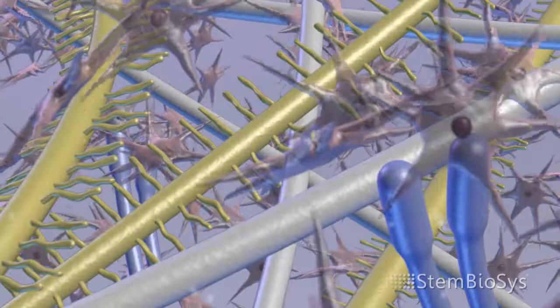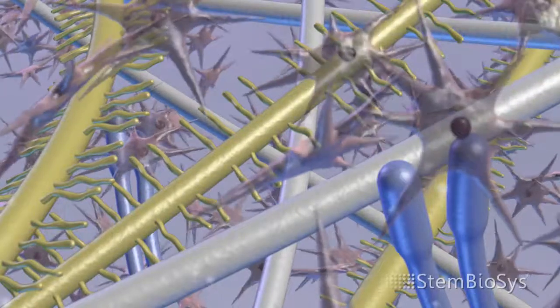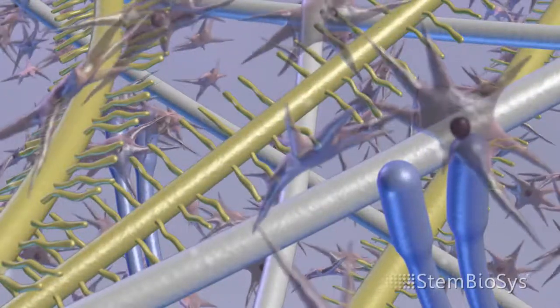This extracellular matrix is a complex, multi-protein composite that mimics the natural bone marrow niche for stem cells.